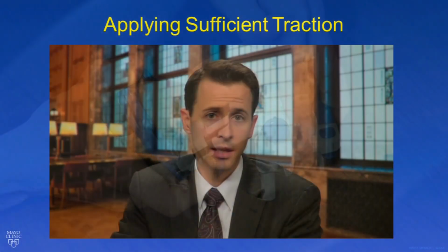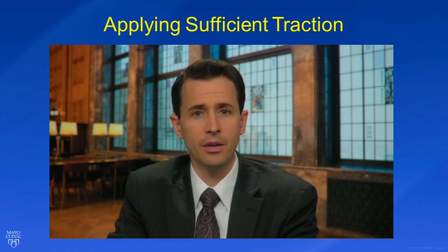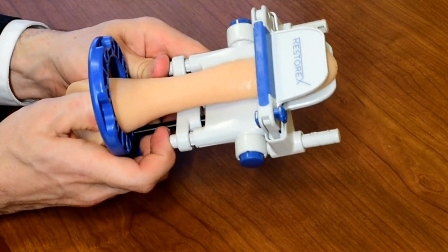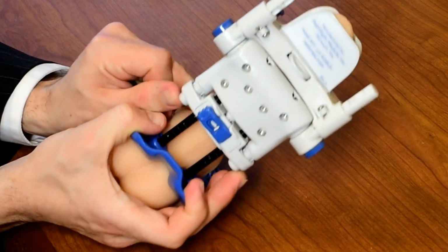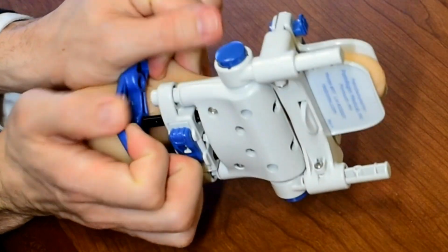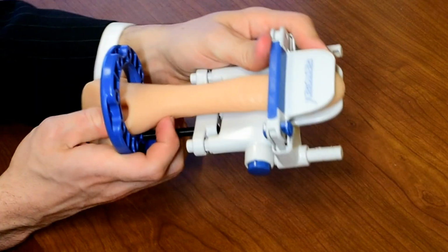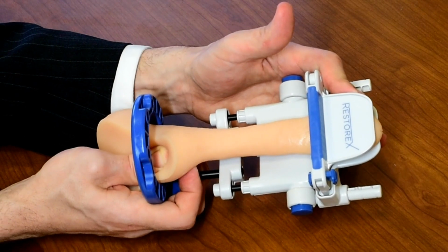Now if more traction is needed, such as if you're seeing too much of the black rods, or in particular if you can see the white line, then you need to do the following actions. First, disengage the springs by applying pressure to the clamp and pushing it into the body. Once the tension's been released, advance the whole unit by using your fingers to push the main unit away from the base ring. We're attempting to demonstrate this in several different views, but you can see that you can essentially use your thumb almost like a wedge to drive between the base ring and the main part of the device. Once you've advanced a few clicks, you can re-engage the springs by activating the spring mechanism. This is done by pushing the unit toward the body.